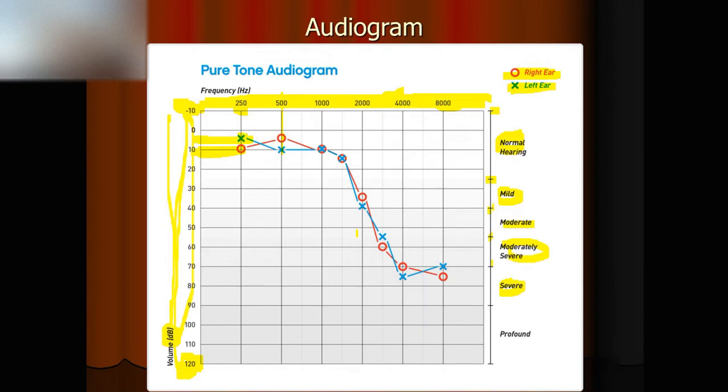Typically, the majority of people, if they have inner ear damage, the audiogram typically shows up like this. Of course, we have different kinds of reversed shape. For example, if a person has neuropathy, his or her audiogram will be a reverse slope like this. If it's a normal hearing person, both curves will be quite flat within the normal hearing range.